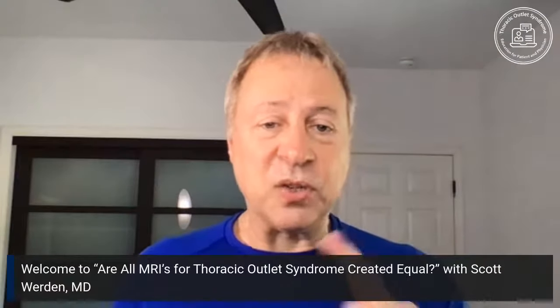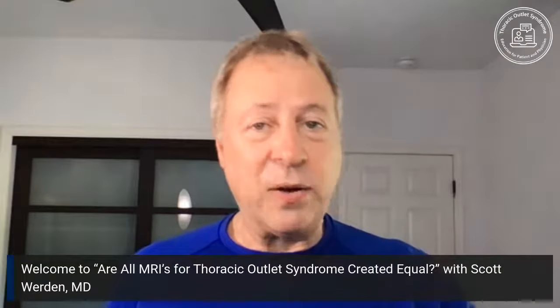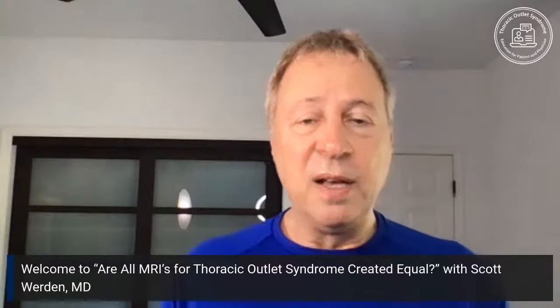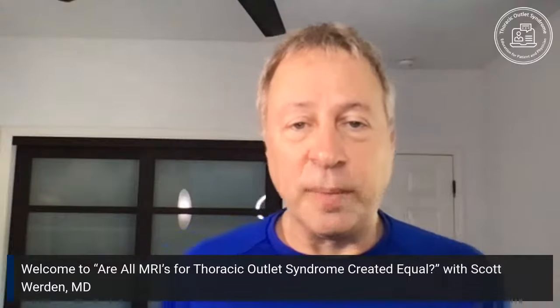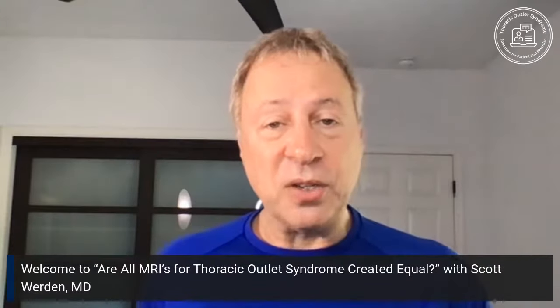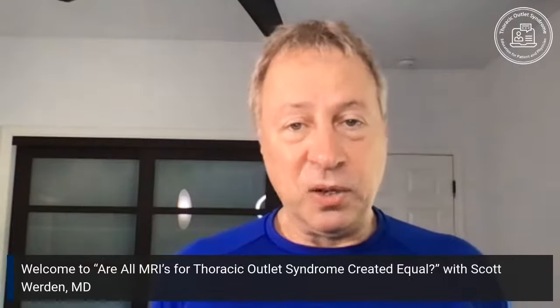And as a radiologist, one thing you need is you need to see thousands of normal images so that you start seeing those subtle changes. Now, a big mass is one thing. Anybody can see that. Any radiologist will see that. But TOS, far and away, is a series of small things, subtle things. So if a radiologist isn't comfortable with the normal anatomy and all the variations, he or she is not going to be able to do as good a job as they might otherwise.